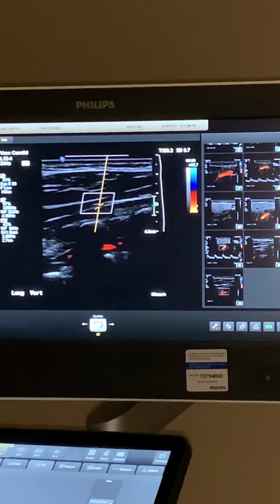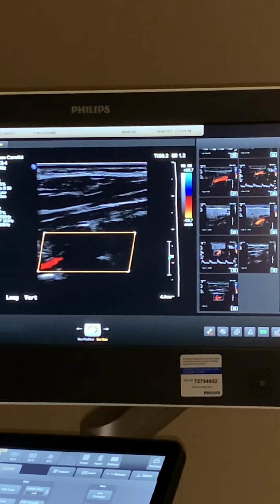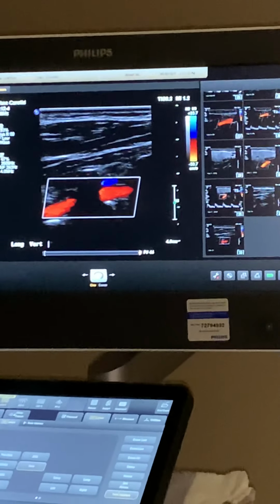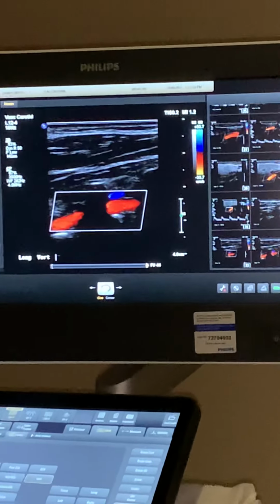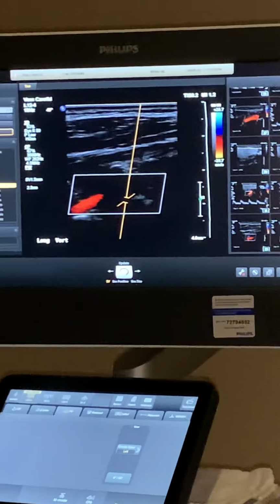Ooh, this is why it's my favorite. Wait a minute. I can get both. And if you notice distally, her angle is more natural, so you might get a better waveform at that distal one. I really like this picture personally. It's gorgeous. It's just pretty. I can't reach your back, but I'll get it in a minute. Pat you on the back.